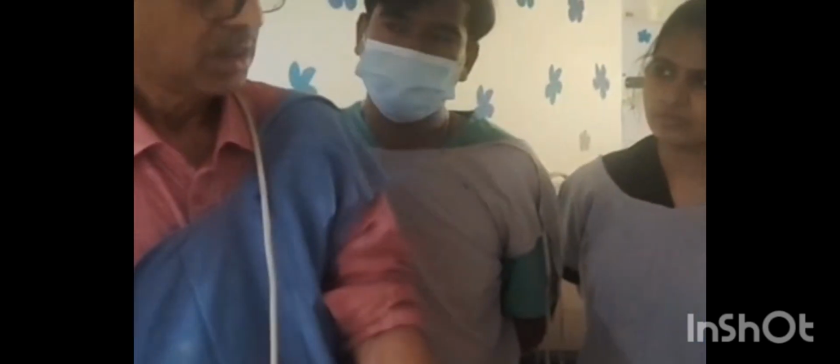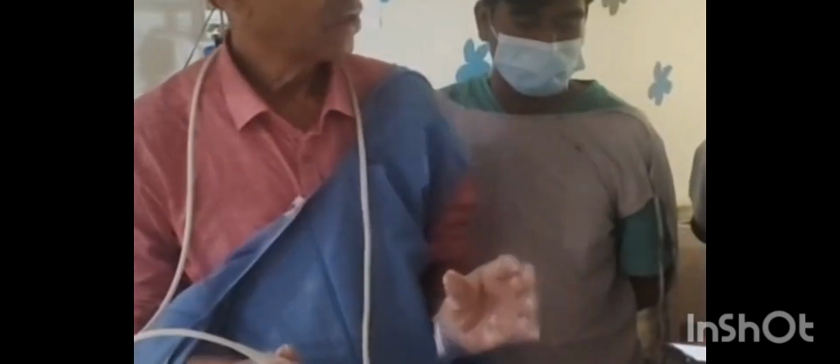So what is the Z score you got? For the left main coronary artery, the Z score is 4.02. Is it significant or not? That is significant. So that means the left coronary artery is dilated here. And what happened to the right coronary artery? 2.72 is the Z score. Is it significant or not?